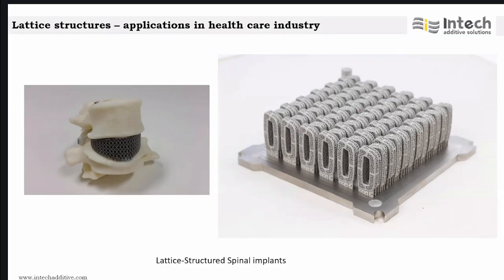You can also go here, and you can see this work has been done from RMIT, Australia. Here you see how the distance metric is happening, how the pairwise distance is calculated. Everything is written here. Okay, where the surgeons design the customized titanium implant.